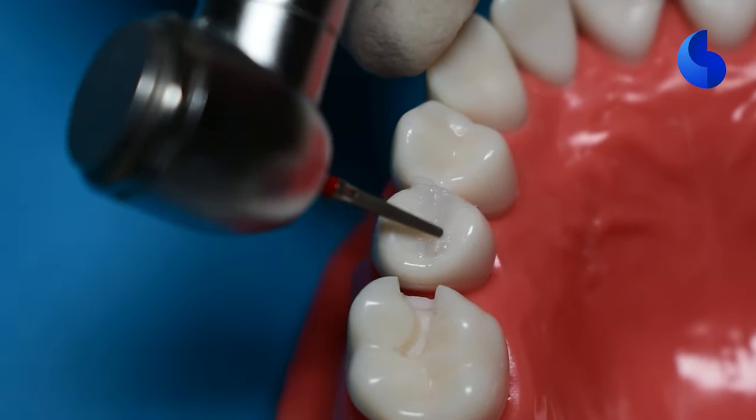At this point, our restoration is starting to look pretty good. You can also use the same finishing point to finish interproximally, where we might have had some excess material. But be really careful. This burr is pretty gentle, but it could possibly cause some scratches on the adjacent tooth if you touch it.